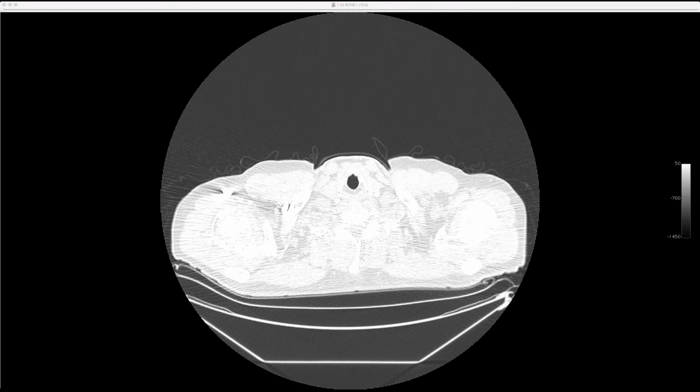And then my companion case is another MALT lymphoma, but this is in a, and hold on, I'll make sure it shows it here. So this is, let's see, there we go.